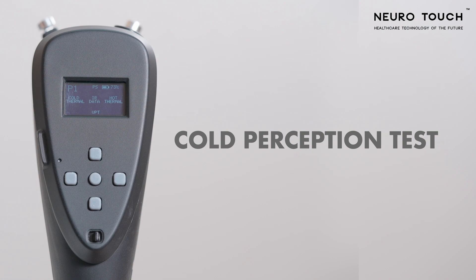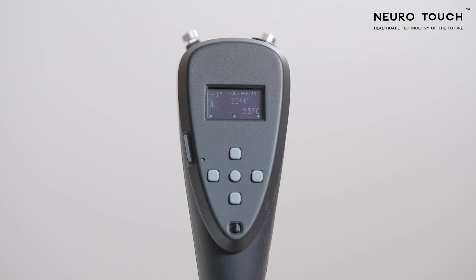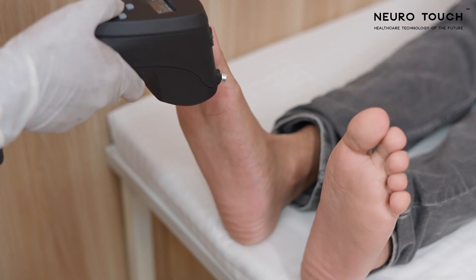Cold Perception Test. Click the left key to start the cold perception test. You can see the test point number on the left with two temperatures in the middle of the screen. The temperature displayed at the center of the screen indicates the temperature of the probe, while the temperature displayed below indicates the temperature to which you can set the probe.